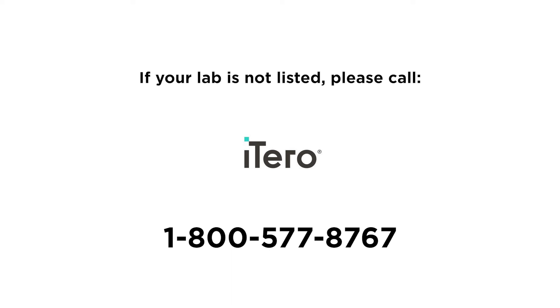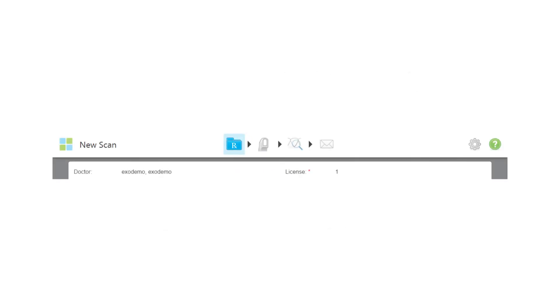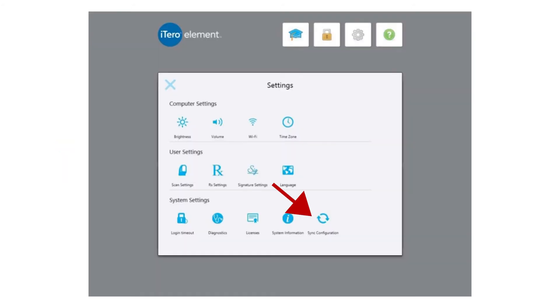After speaking with iTero, return to your device and select the gear icon in the upper right corner of the screen to open the settings tab. Select the sync configuration button in the bottom right to push the new lab to your device.